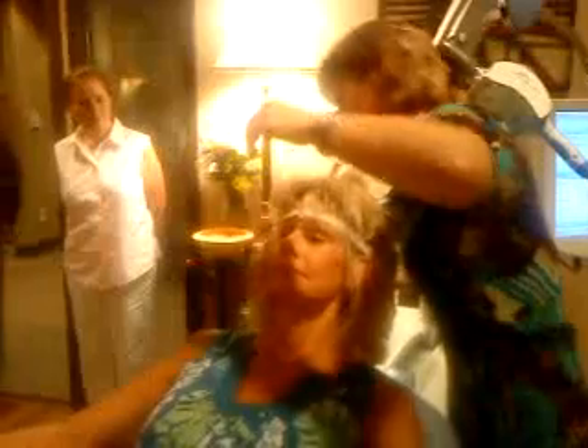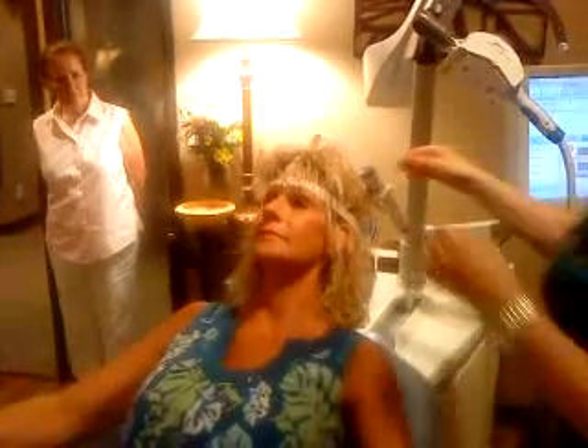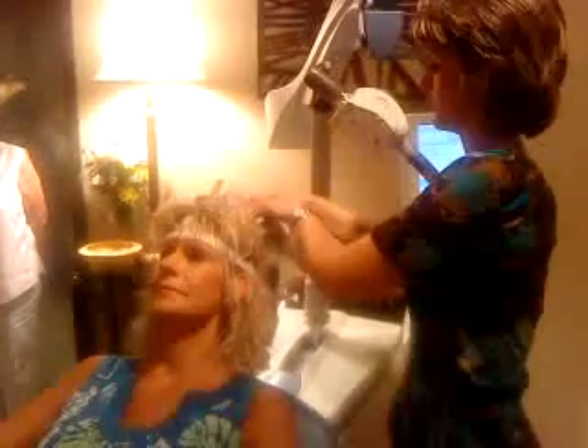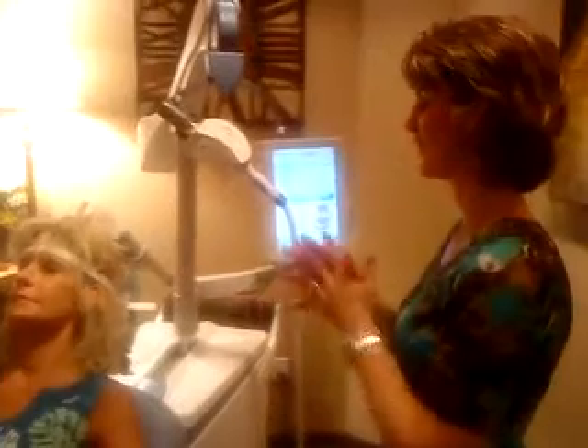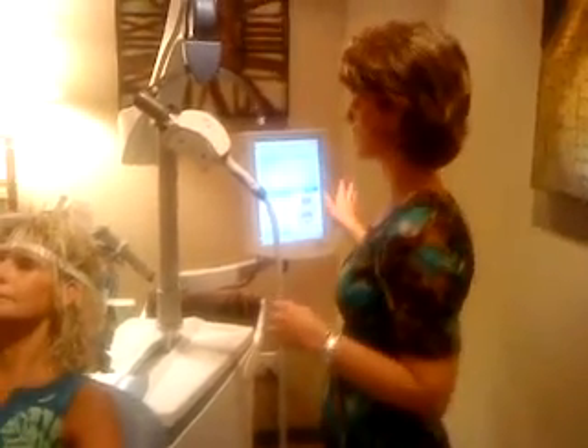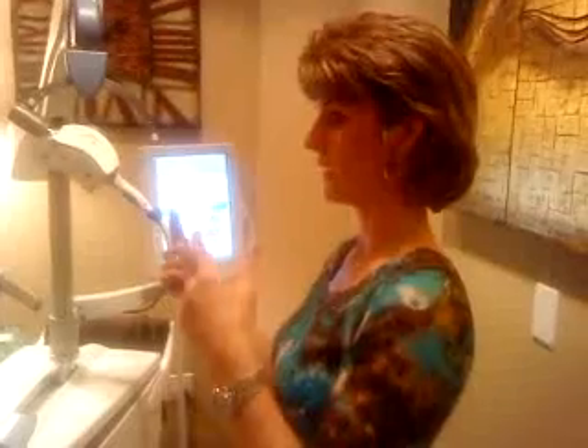We do a lot of work because we've already done this before, so I'm used to doing it in a certain order. These straps not only help with positioning but also help with keeping an individual's head in position. Lots of times people are worried whether they should cough or sneeze. The straps are just velcroed, so patients are not strapped in — that's important for anyone who's claustrophobic.